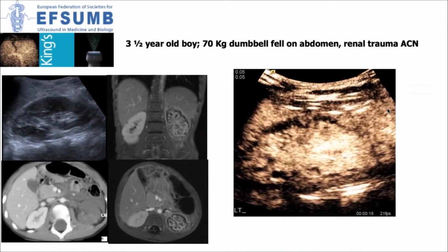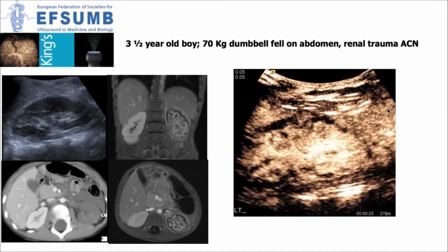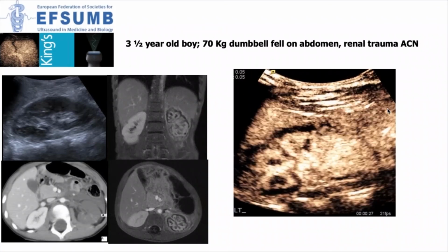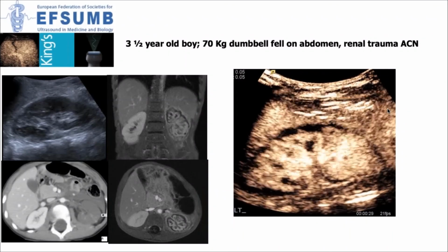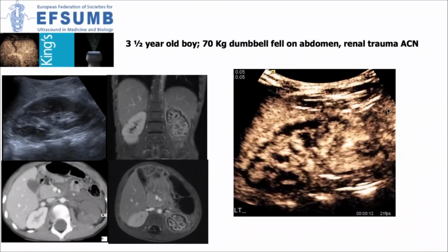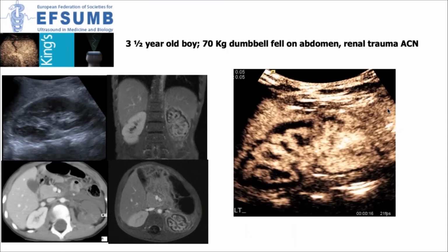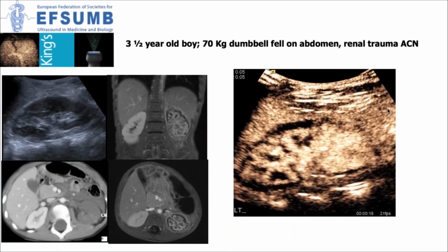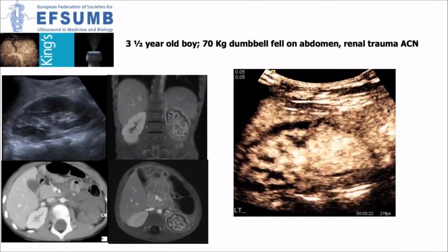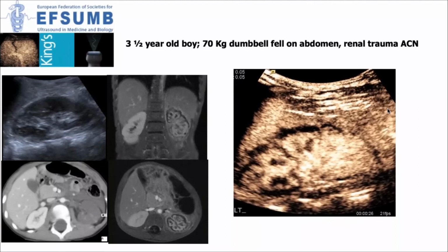The patient underwent a contrast-enhanced ultrasound. Actually, what you can see is the kidney is supplied by medullary collaterals. What you have instead is a very exquisite example of cortical necrosis, which was echoed on the MRI. But actually, again, it doesn't require a general anesthetic. It doesn't require potentially harmful gadolinium contrast. And in terms of a follow-up CT, obviously radiation was not something we would desire. So that's why the patient had an MRI. Instead, a contrast ultrasound shows you entirely everything you need to see.